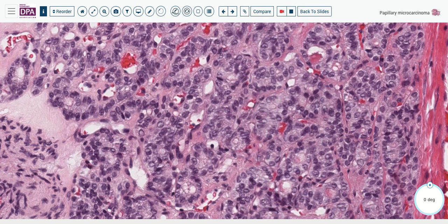features. Despite that, when it's an encapsulated lesion like this, you might be wise to measure the entire diameter of the lesion, not just the area which has the nuclear features.